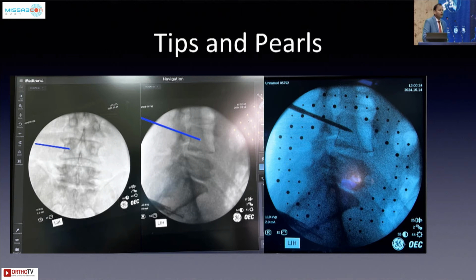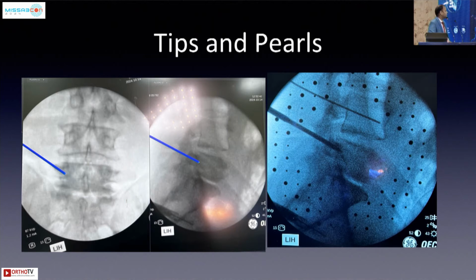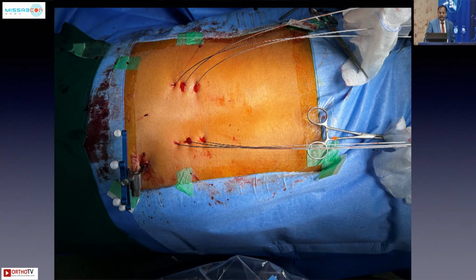So this is just one X-ray shot. And then again, same. If I'm doing L5, again this image, and then I shoot one other X-ray. I know it's matching up. It is not fallacious, and I'm very confident now. So now I'm very confident, so I generally use X-rays once you put the guide wires in, and then you can do your T-lift job.